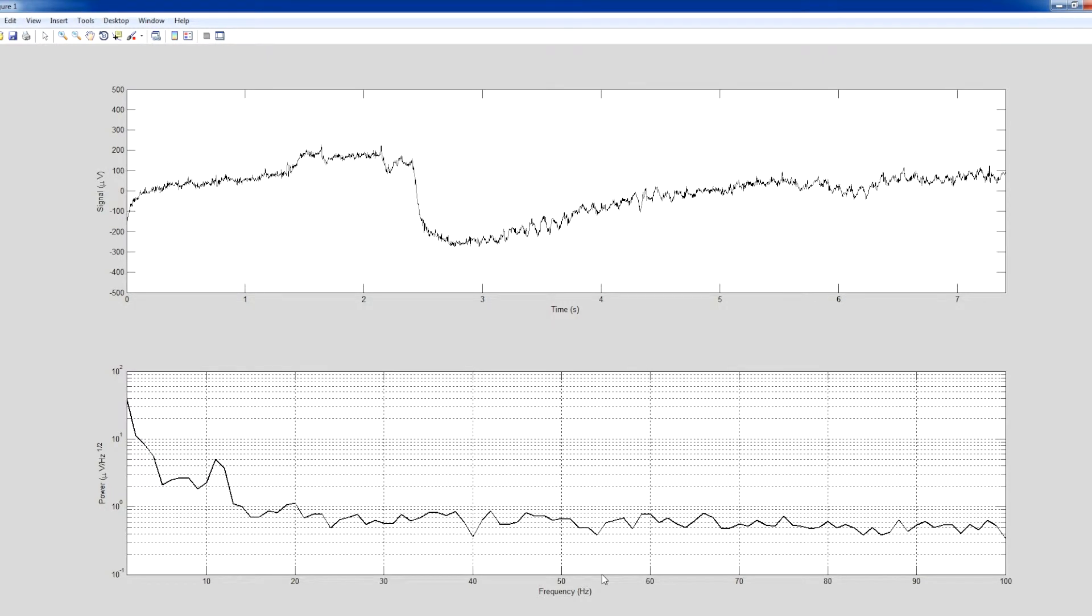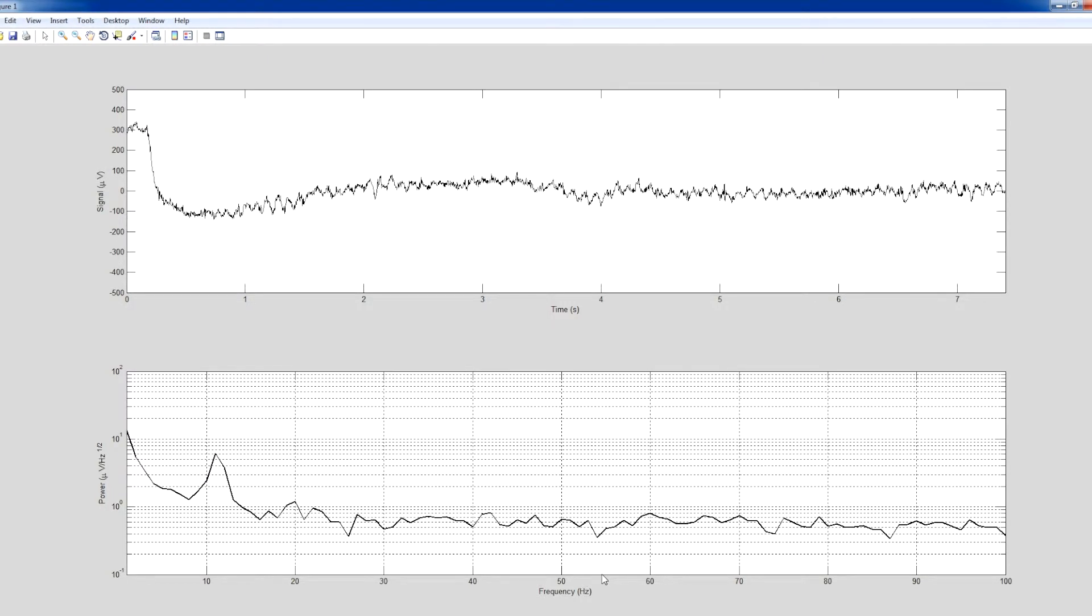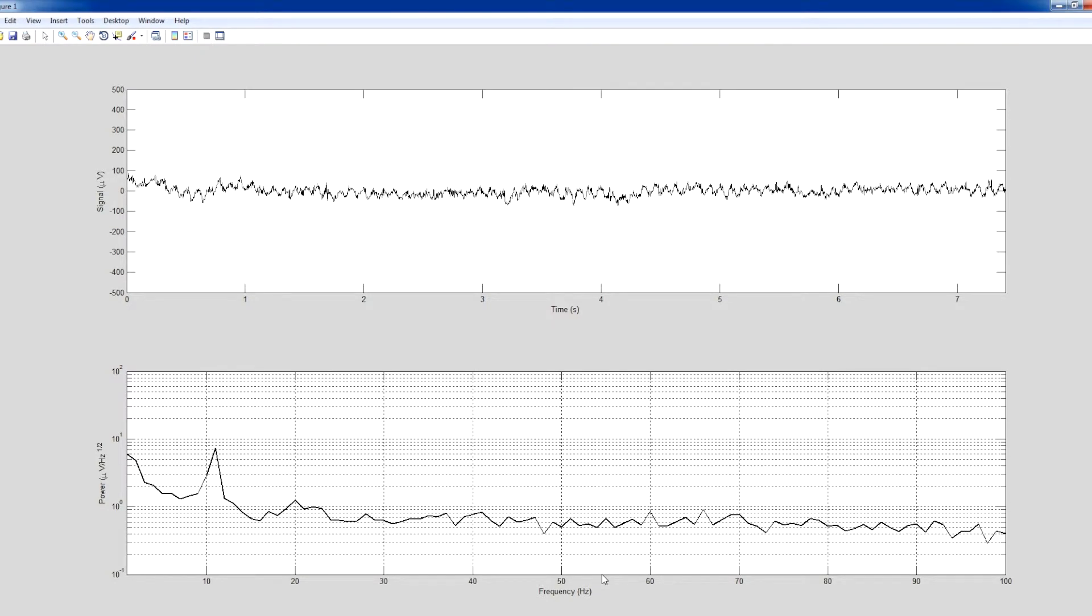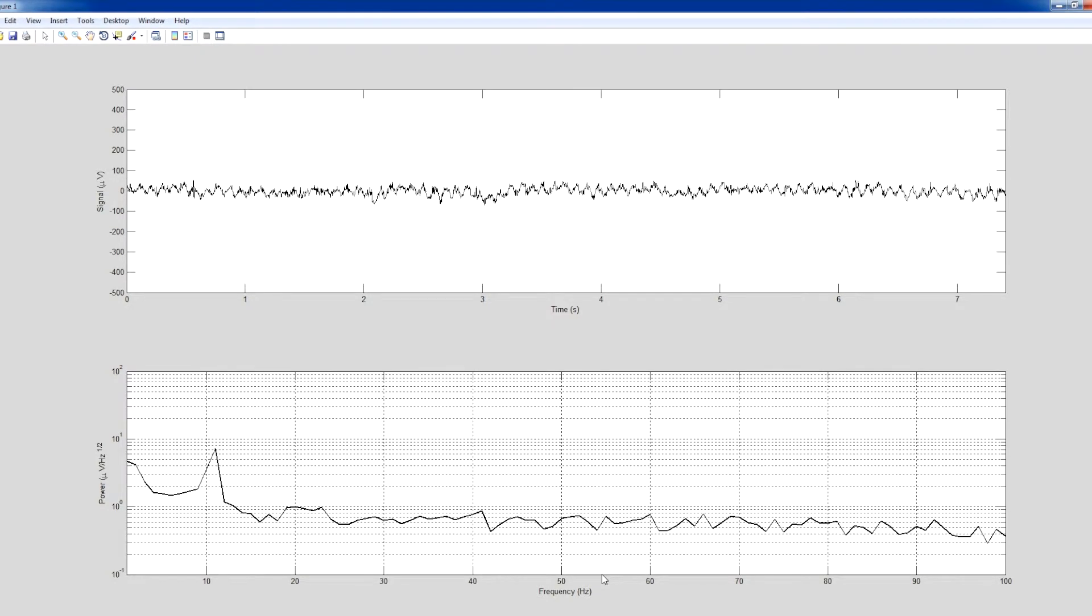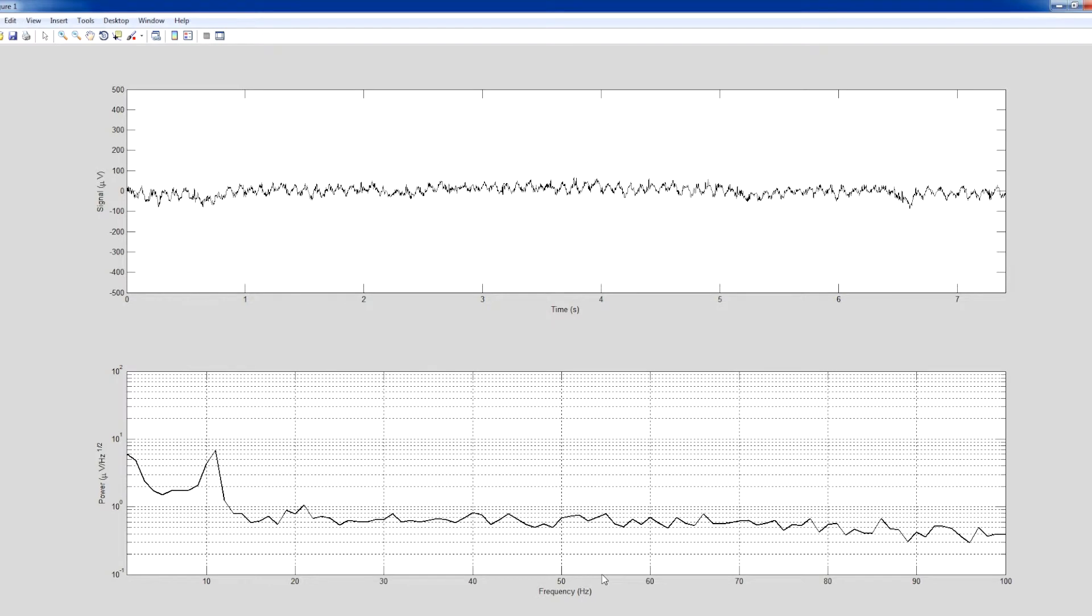Now let's look at what happens when the subject closes his eyes. As expected, we see alpha oscillations in the raw EEG and a buildup of energy at around 11 Hz in the power spectral density.